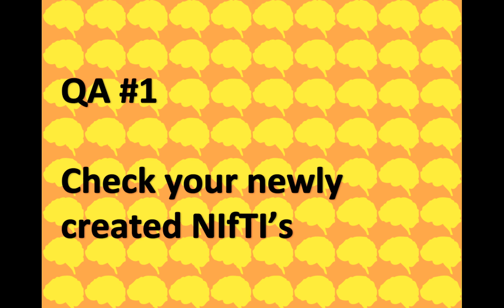There will be a link in the info box to a Tumblr post I posted, and in that Tumblr post is a line of code that could possibly work for you. Of course, you have to install whatever you need to install for that line of code to work. You can Google it and find it. But anyway, I think that line will work for a lot of you to convert your DICOM to NIfTI.